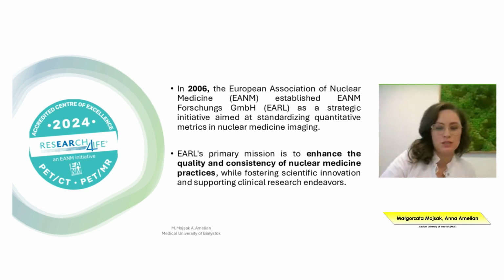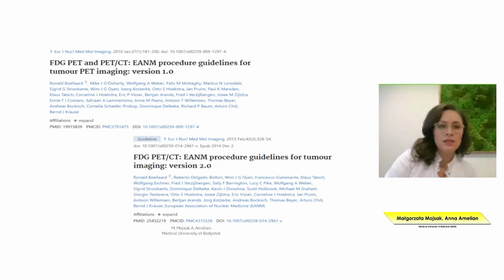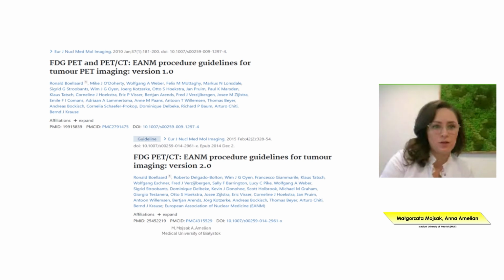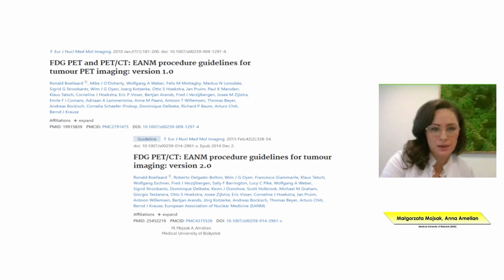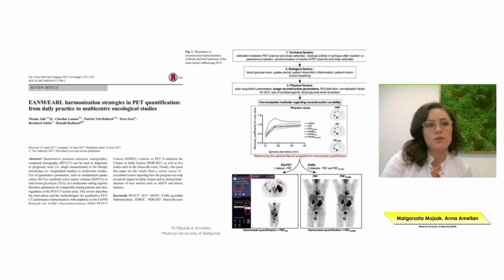and to make sure that these examinations are repeatable between scanners and patients. In 2010, the first article appeared, and it provided the procedure guidelines for PET imaging. Five years later, another article appeared, and it provided revised data and more information about further development of the accreditation.